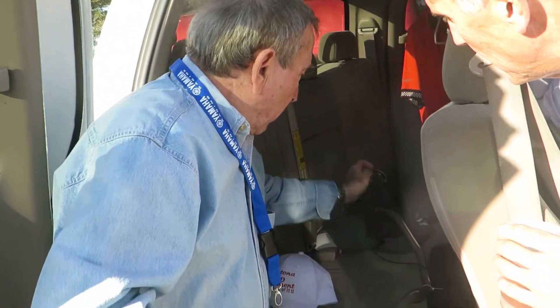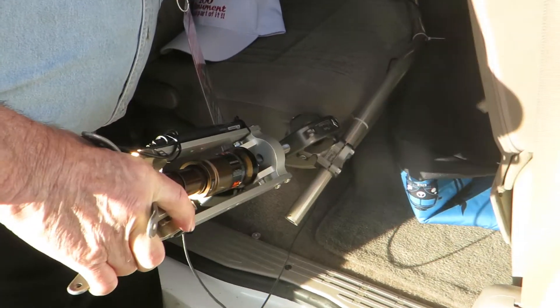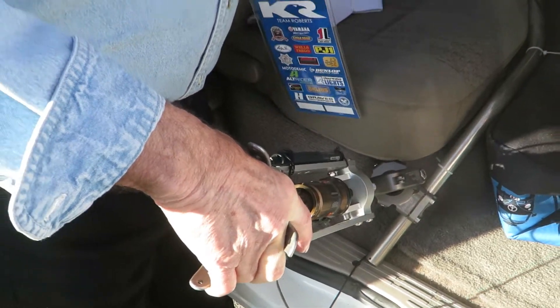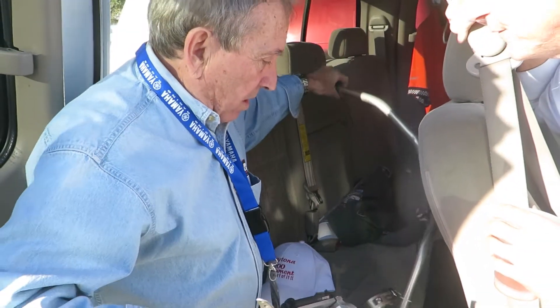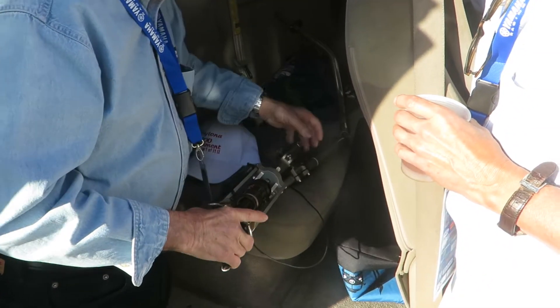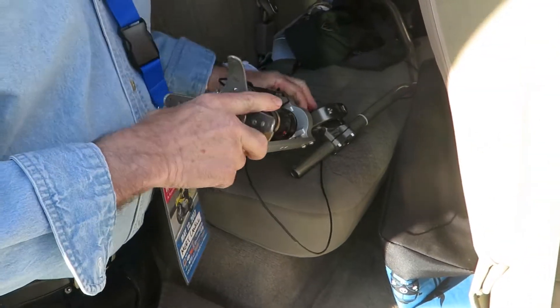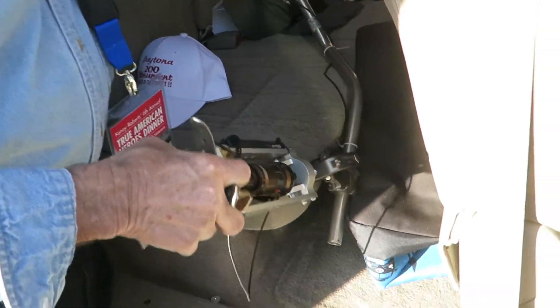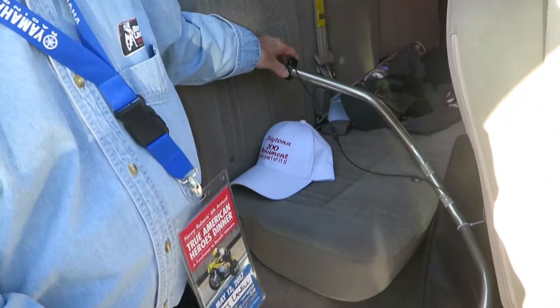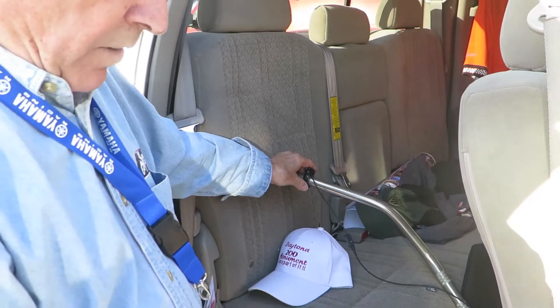It works, and then when you come to a hill you can lock it out — just go click like that and it's locked. Did you machine all those parts yourself, or did you do the prototypes? I did the prototypes. I have a machine shop where I do the work. So how did you get it so you can adjust it? I've got a control on the handlebar — it's an electronic shock.